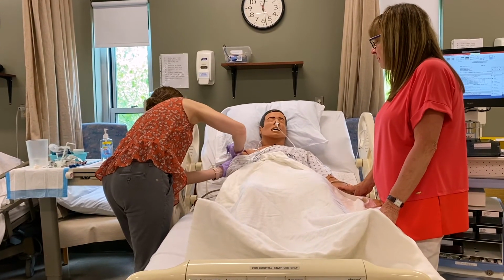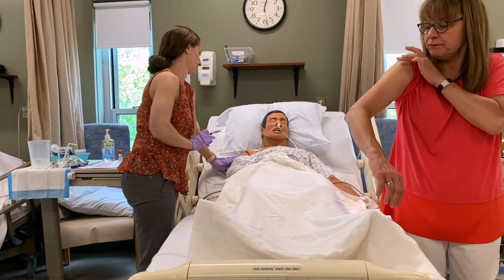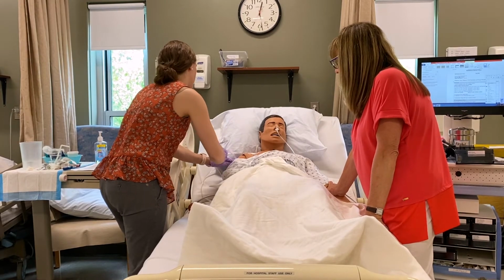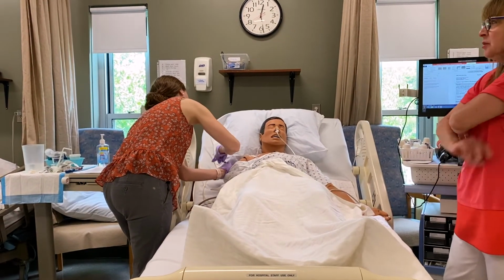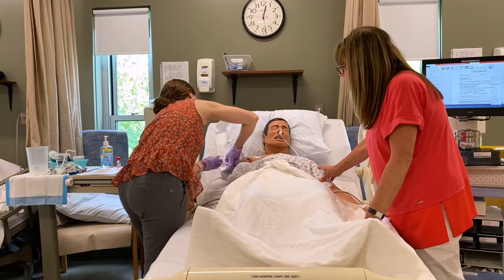She's going to palpate the acromion process, which is right here. 2 finger widths below. Good. I'm going to spread. Spread for IM, pinch for SC. Okay, straight in. I'm not going to aspirate. It's a vaccine.